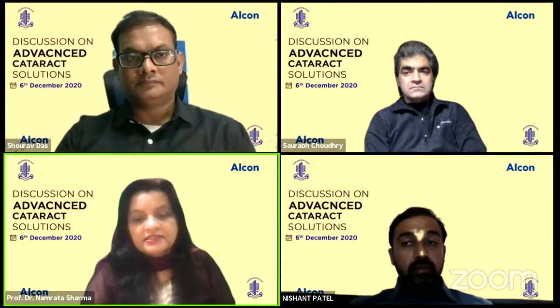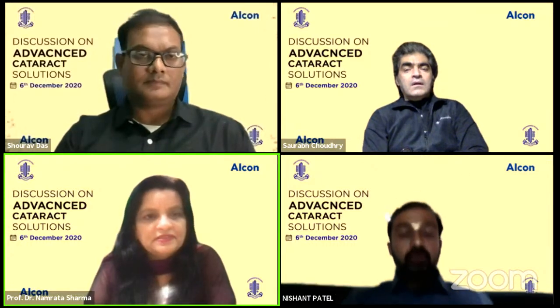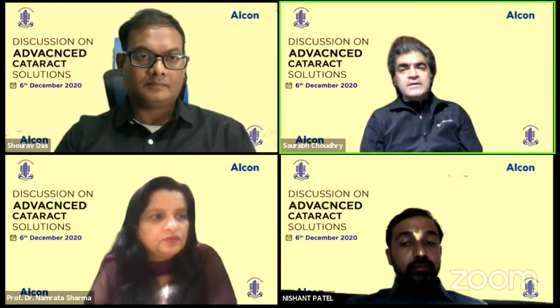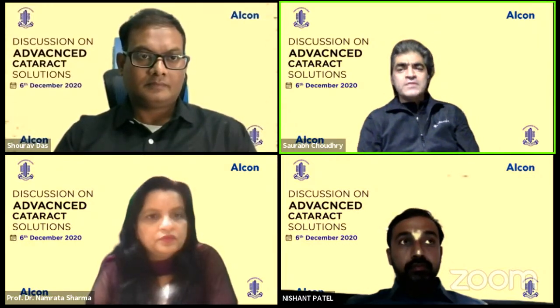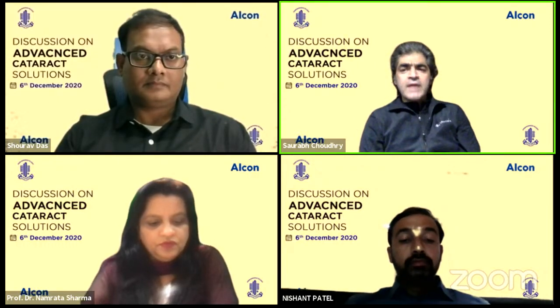There is another question for you, Saurabh: can this tip be used with other machines or other handpieces? Unmute yourself, please. Sorry, yeah. So this cannot be used with other handpieces. I've tried using it with the Infinity platform as well. So it works on the Centurion and the Infinity platform, and I think it can be used on the Laureate platform as well. But it cannot be used with other companies' machines because the tip will not fit.